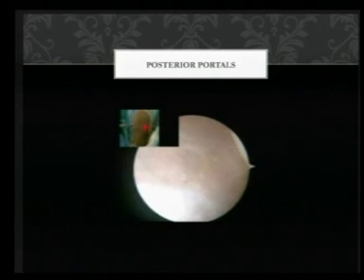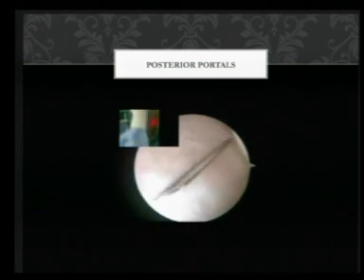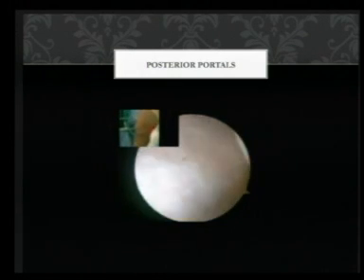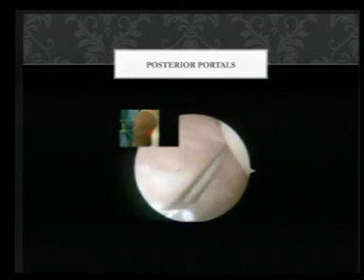Pass the needle first, in flexion 90 degrees, and just make a small slit in the skin, then use your hemostat to push all the important structures away, and then again you make a cut with your knife. Otherwise you can injure the important structures in the posteromedial or posterolateral corner.